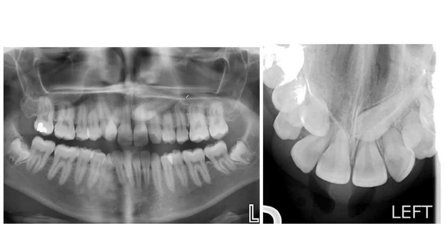In this presentation, I will show you how to localize impacted canines using both the vertical shift rule and horizontal shift rule, and on a CBCT — especially in cross cuts — because otherwise in the CBCT you can easily localize the canines.